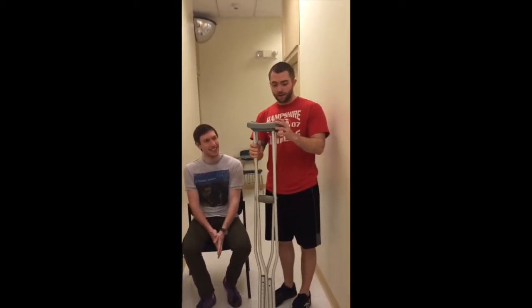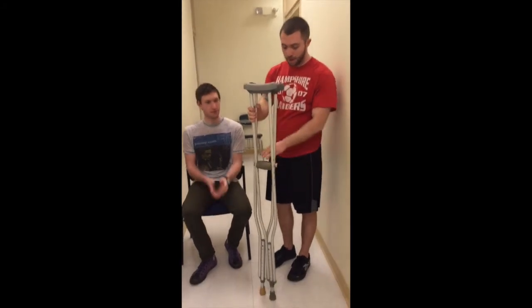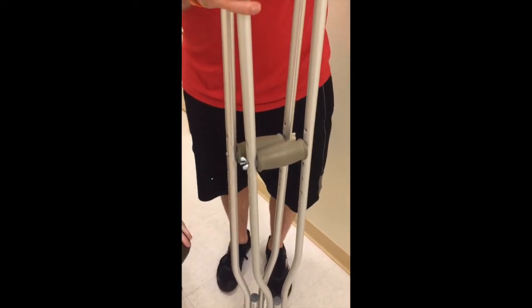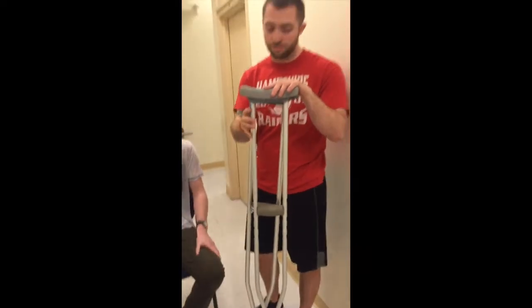So what I would do now is I would alter the hand grip height and then have Will come back up, and then we would check to make sure that he fit. And the big thing is that you always want to check the fit before you have them ambulate. That's super important. Do not assume that it fits.